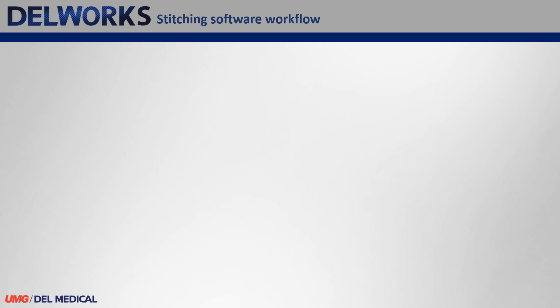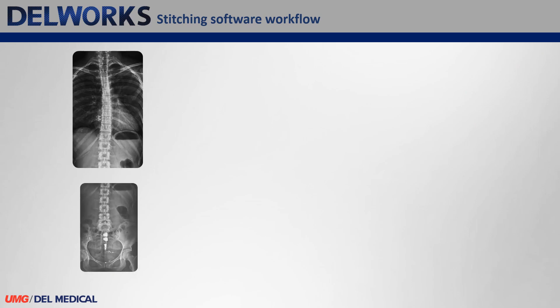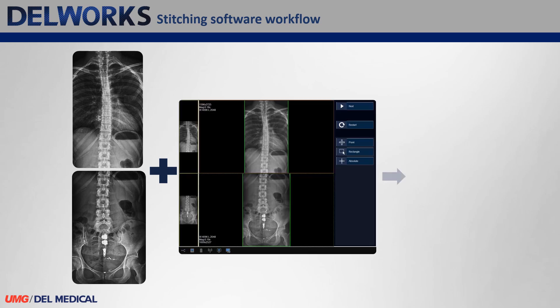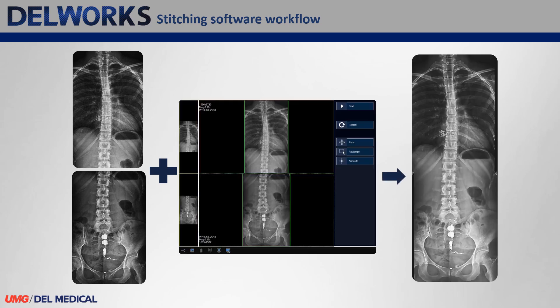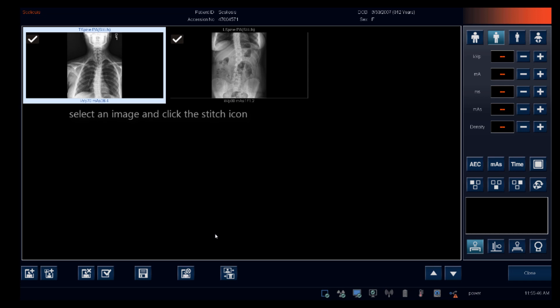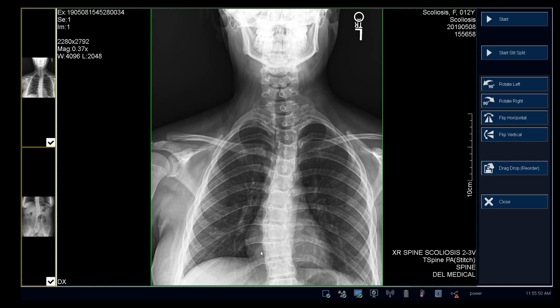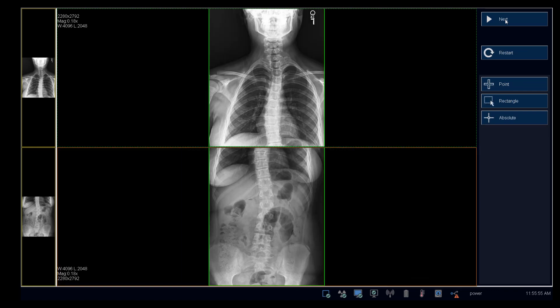After acquiring all of your images, you will stitch them together in Dell Works, creating one final long bone or scoliosis image. From the acquisition screen, select an image and click the stitch icon. Click Start, then click Next. The stitched image will be displayed.